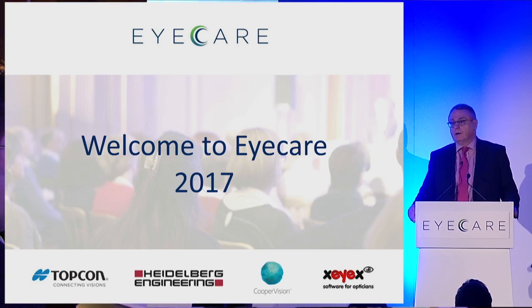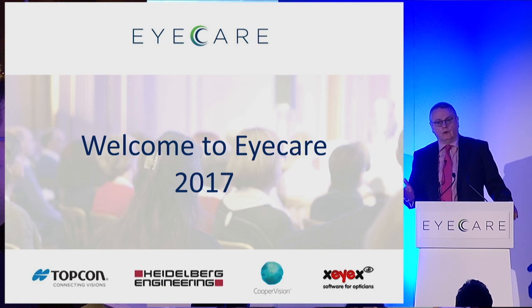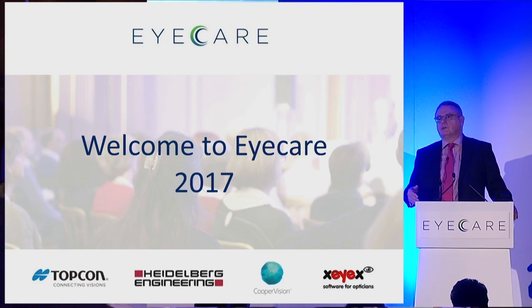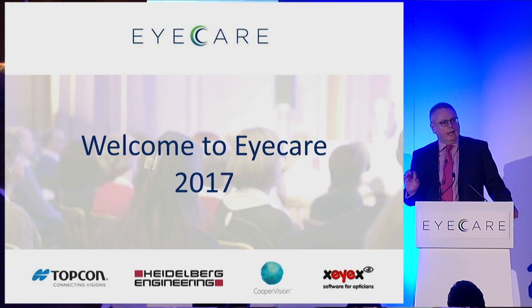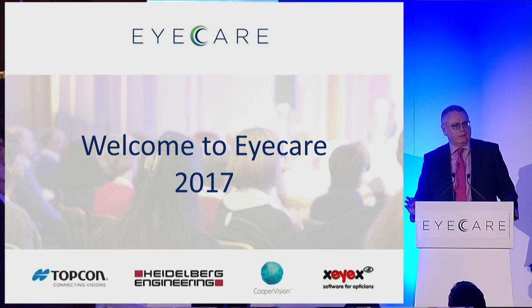We've got a variety of different macular pathologies to review, but before we start that, what we will do is go through what is normal to start with. I think it's important to review normal OCT anatomy and also a very straightforward approach to macular assessment. In doing that, we're going to scan one of my colleagues, Nick Timms, who's again kindly volunteered to have his eyes scanned. All of our subjects are undilated. Obviously, we didn't want to put drops into people's eyes if they've then got to travel home from this meeting. It seemed a little unnecessary.